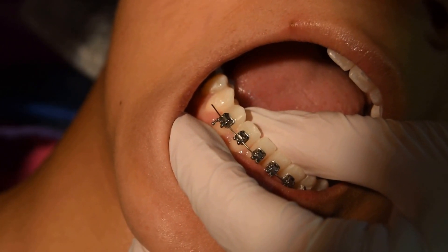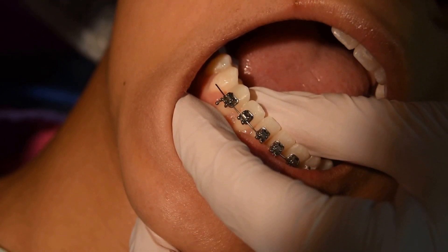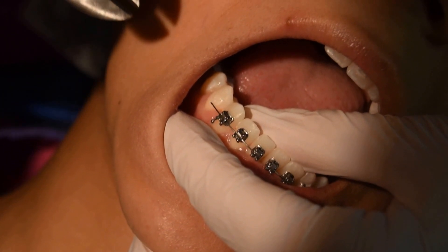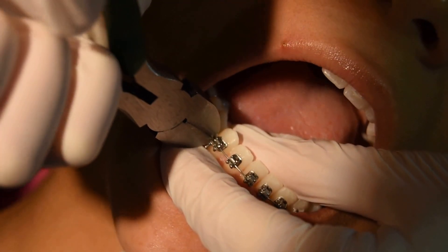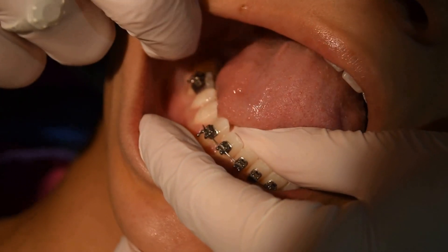Just to show you how to do it with a wire cutter — these are relatively inexpensive and a lot of people have these at home. Whenever you have a wire sticking out or poking or something loose, just go to the closest point where it attaches to the next attached bracket, give it a little snip, and then make sure you remove the piece that you cut from the mouth.